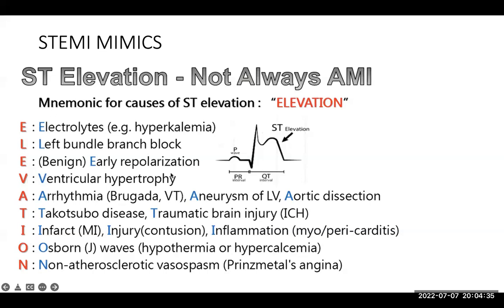I'll share the slides with you. You can go through them one by one. And that is the first part. We have finished acute coronary syndrome. I hope you'll be comfortable identifying what segment to look at, what territory to look at, what ST segment elevation is, what it implies, which artery is blocked, and what you are supposed to do.